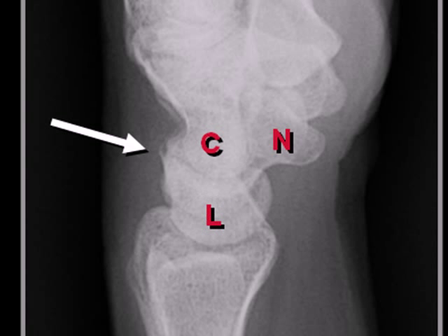On the lateral view, we see the lunate and the capitate line up with each other, as well as the distal radius. We can see the navicular, or scaphoid, anteriorly and on the dorsum of the wrist. The white arrow is pointing to the location where the triquetrum is.